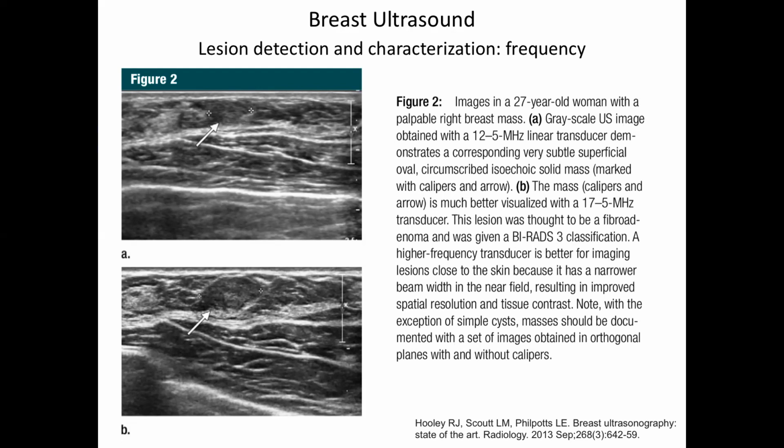So it takes a lot of experience, and the fact that you're there with your transducer in your hand and the breast is right there, so you can palpate the mass itself, right? You can look and say, oh, okay, there's something here, bang. And then take this picture and you know what it is, right?